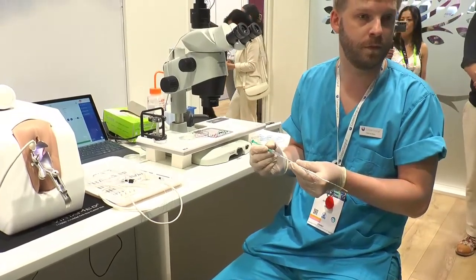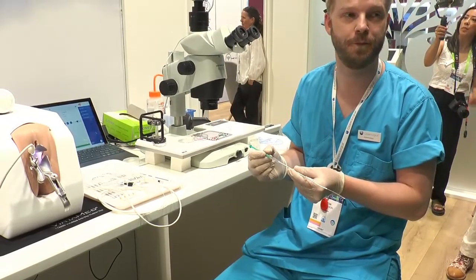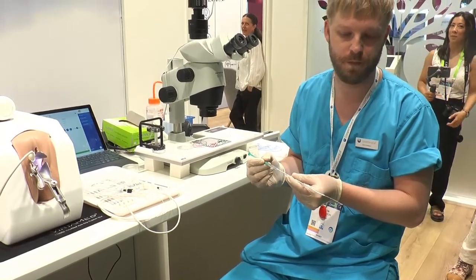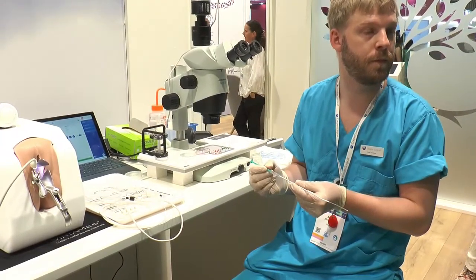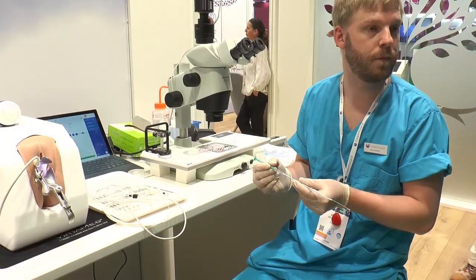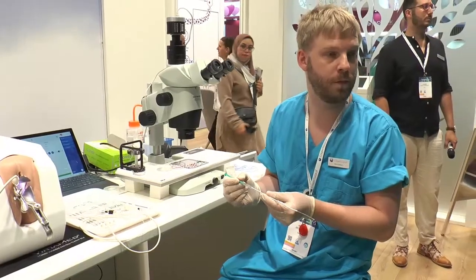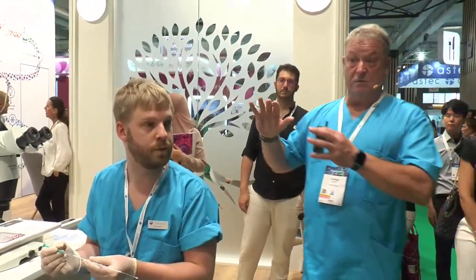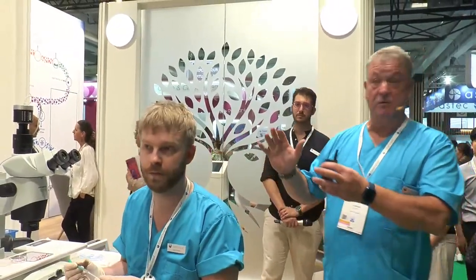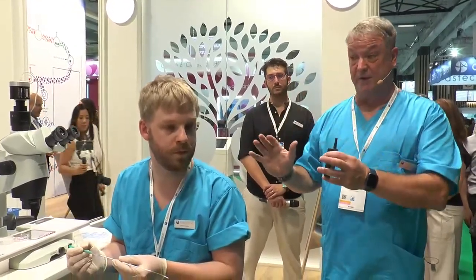So that would be where whoever's doing the transfer gets the outer sheath and an obturator into place first. As soon as they know they're in the right position, they call to the embryologist, I'm ready. They would then load the catheter and bring it through, but this time, instead of bringing the whole catheter, they'd just bring the inner part, and we would feed that through. So we train embryologists, we do mock loading, we get them to do these things so they practice time and time again, so they're very skilled and quick at doing it.